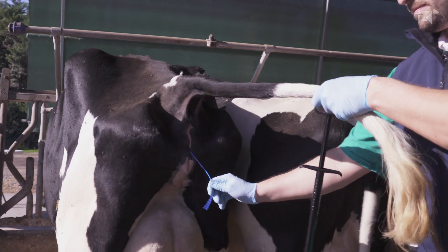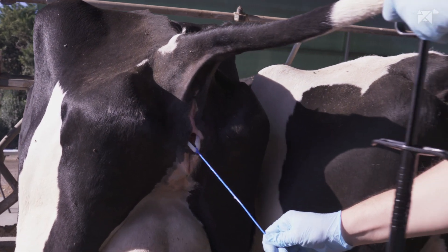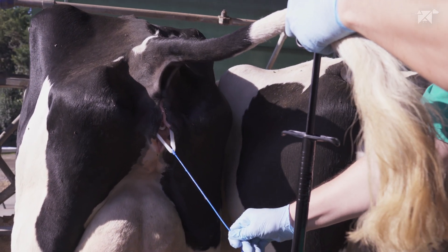To remove the device, we will gently pull from the grip tail, allowing the device to be released.